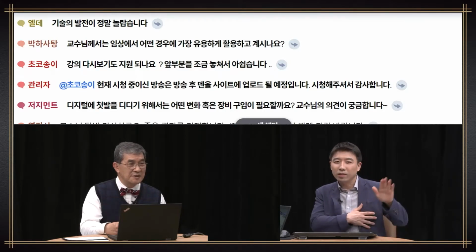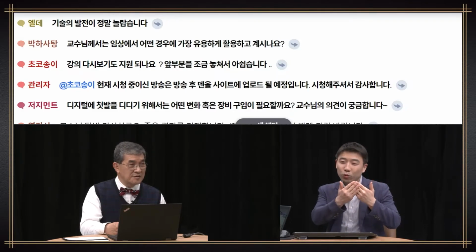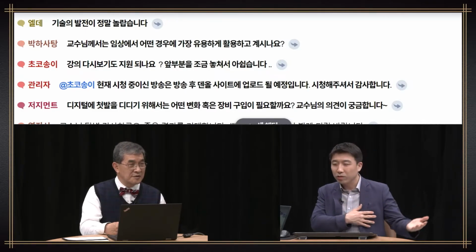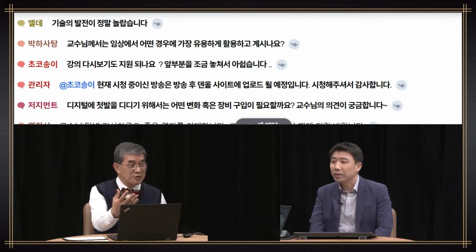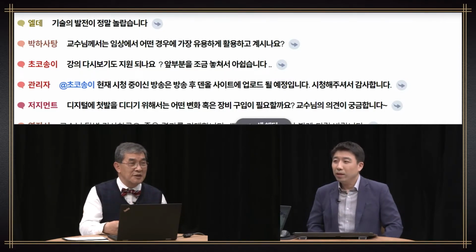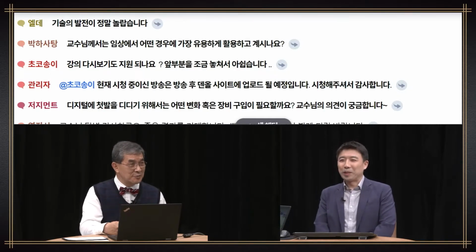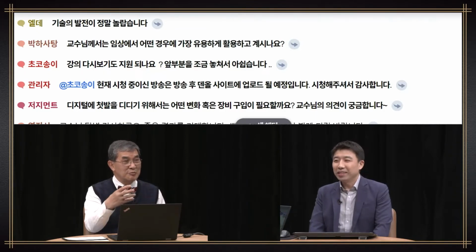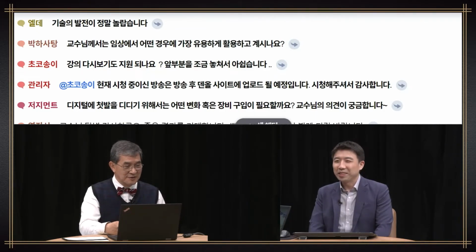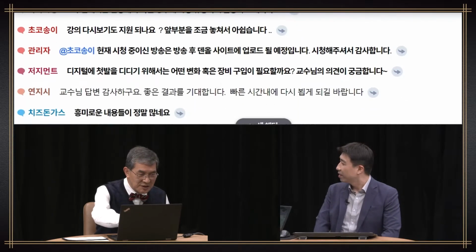Rather than just blindly saying that you have improved so much, you can provide objective data. You can merge and show the patient how much it has protruded. Therefore, it can be of great help. You can show it ahead and the patient has agreed in advance. Therefore, I believe there will be much less complaint. Yes, because the patient has accepted in the first place. At times, when you provide prosthesis, the patient can complain a lot, but this can really help.